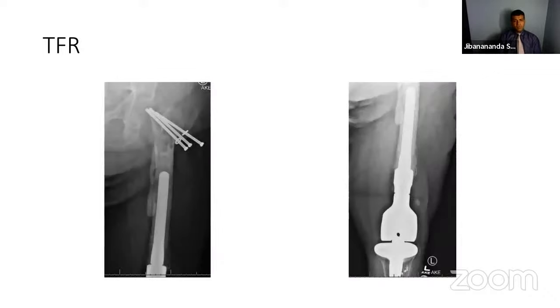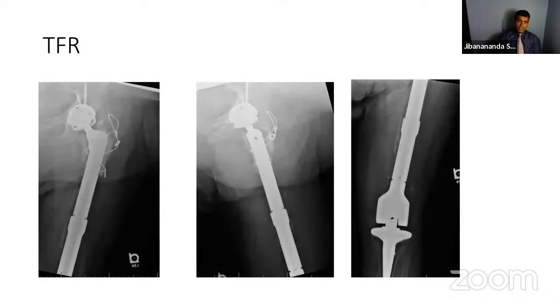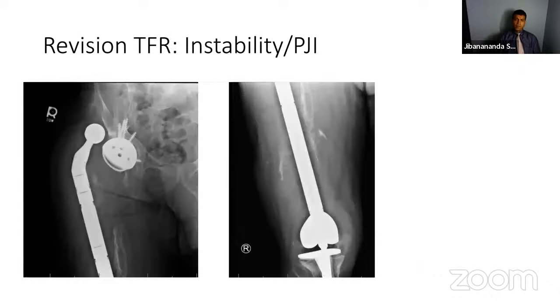There's a patient that was referred to me. The patient had a previous DFR, then had a fractured neck of femur, and an attempt at screw fixation that failed. I don't see any other option on this one other than a total femur replacement. So we did that. I used a constrained liner. Again, I preserved the trochanter with a figure-of-8 wire to hold the abductors, which has always worked for me. She did well. She had other issues, COPD, obesity, other things. Her mobility is limited, but she has no pain, and she's doing well at a 1.5 year follow-up.